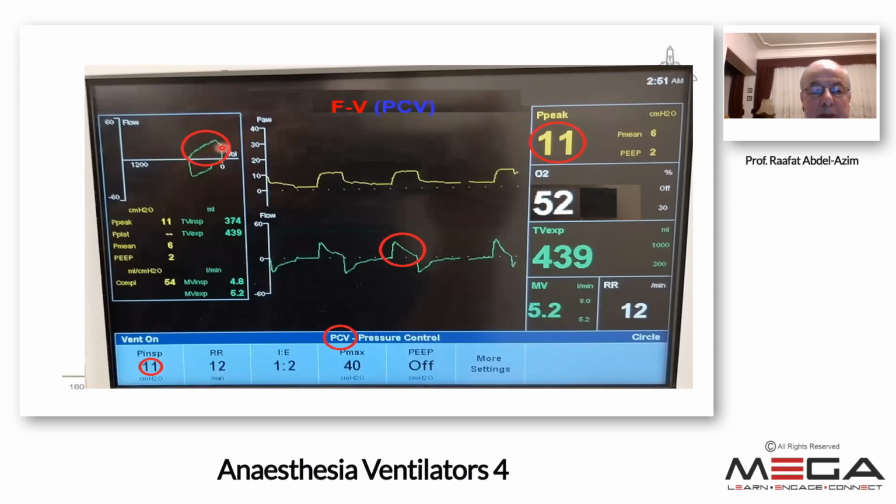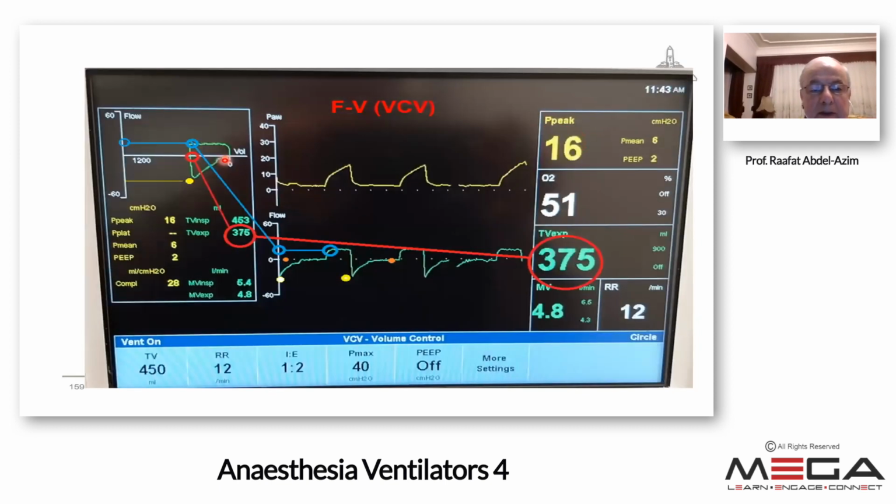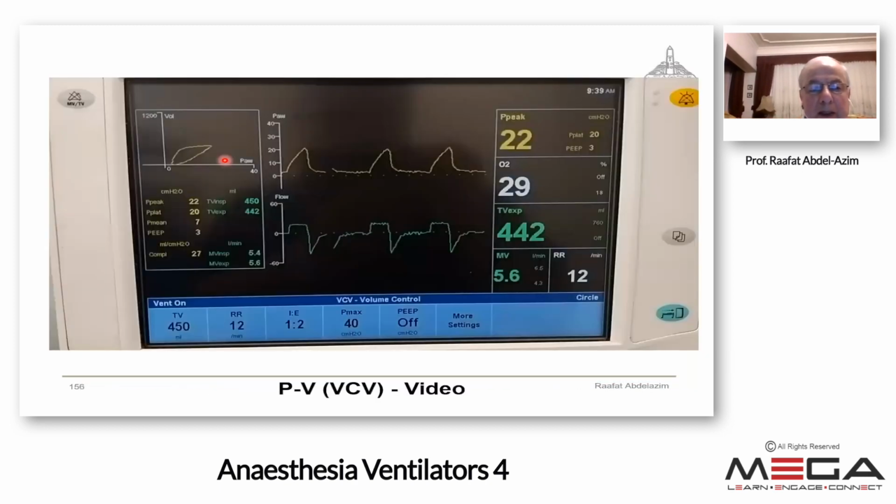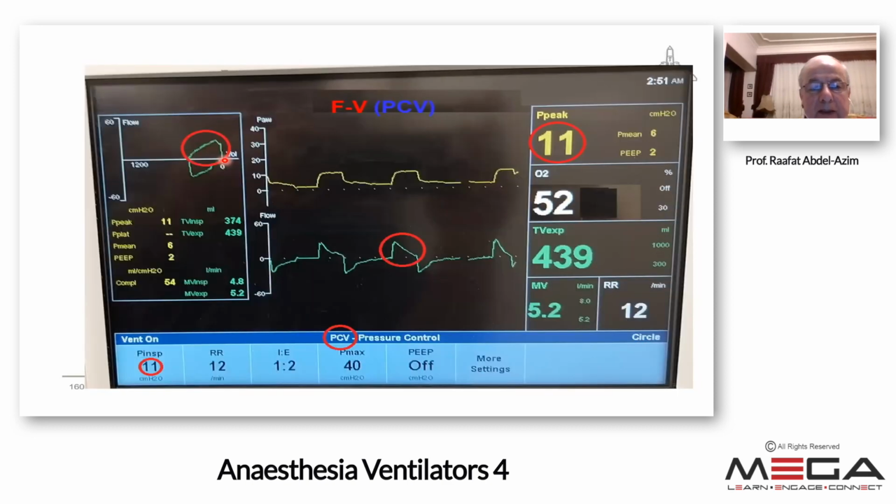The flow is going up until reaching its peak. Then it is decelerating, not constant like before in volume control, until reaching the end inspiratory point. And the reverse will occur with no difference between volume control and pressure control during expiration because it is passive. You see now the difference. Here is the flow volume loop during volume control ventilation. And this is the flow volume loop during pressure control ventilation.